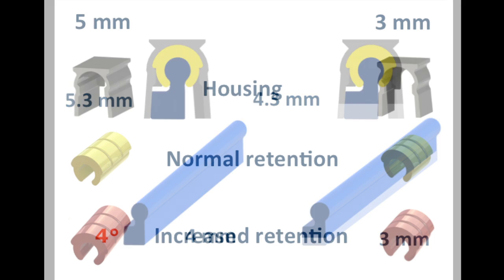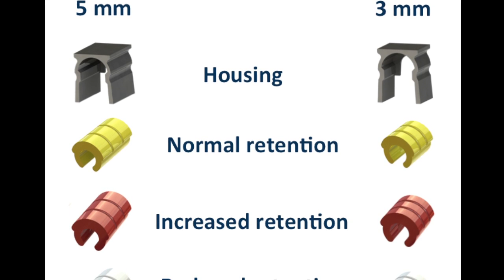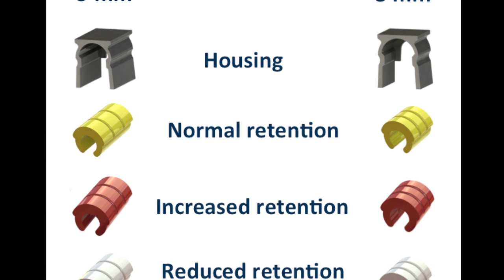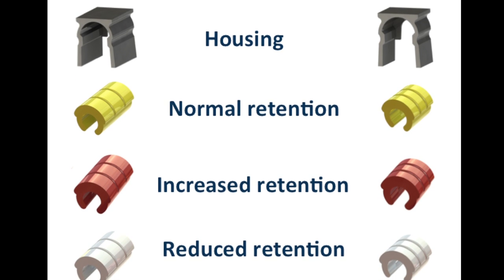When the implants are close together, there is often not enough room to place the normal 5 millimeter long Hader clip. Another OCAD improvement is that the riders are available in 5 millimeter and 3 millimeter lengths.